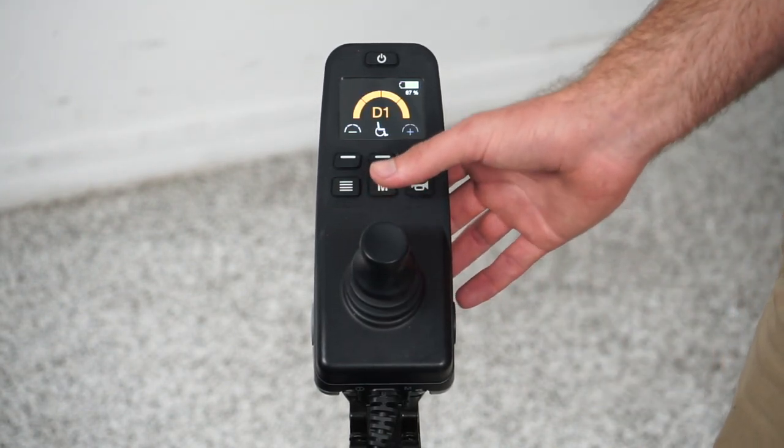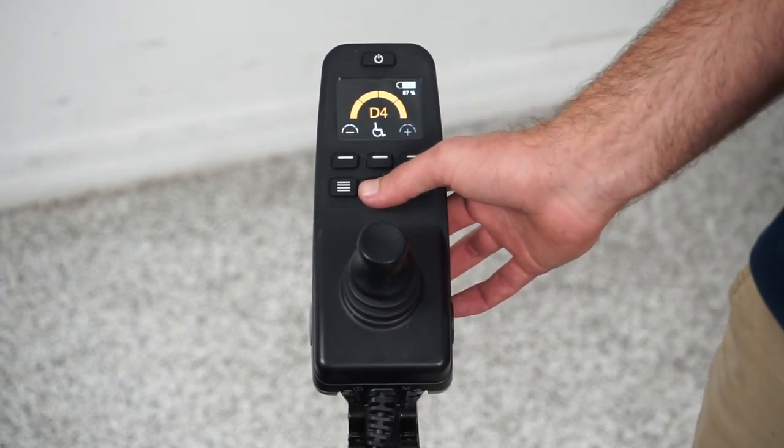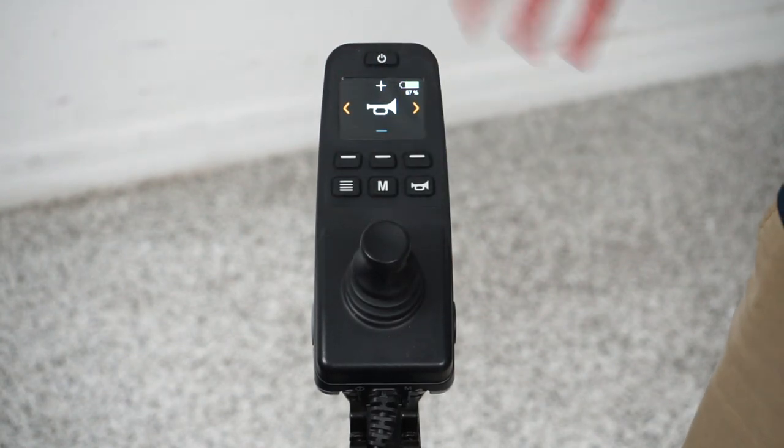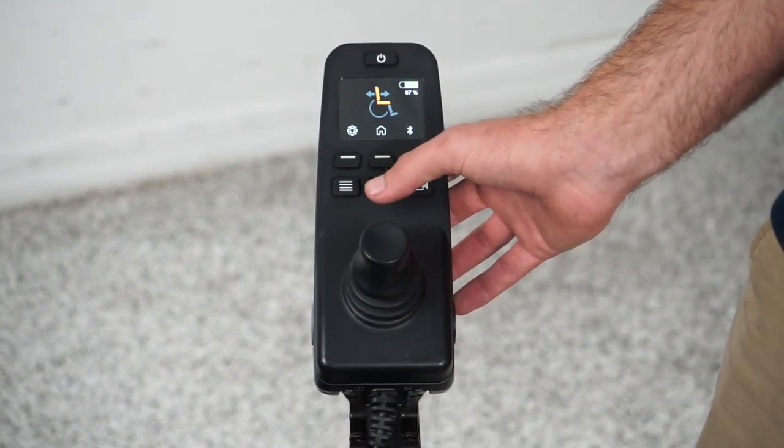No matter where you are in this joystick, it can get a little confusing to operate. So if you ever get lost and you're not sure where you are, just press mode — it will take you back to where you want to go.